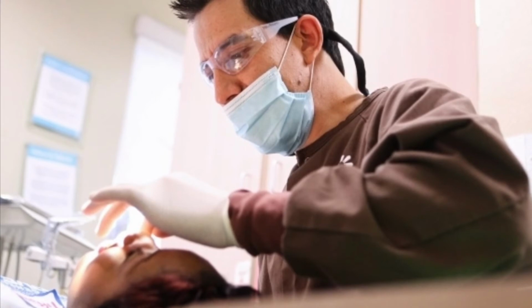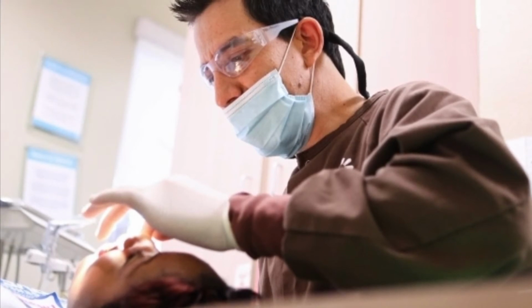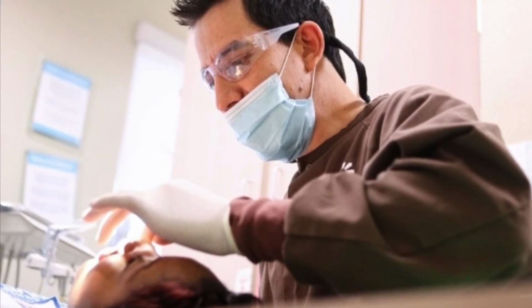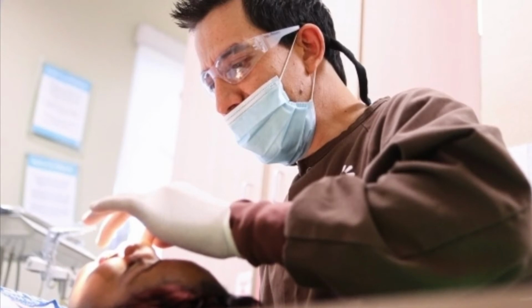And then number 4, radiograph the tooth to verify the position of the instrument. Number 5, readjust the file length according to the radiograph result. Results are either fit, too long or too short. Of course, you have to notice that the bisecting technique in X-ray can't measure the exact length of the tooth, and the parallel technique is the more accurate one.